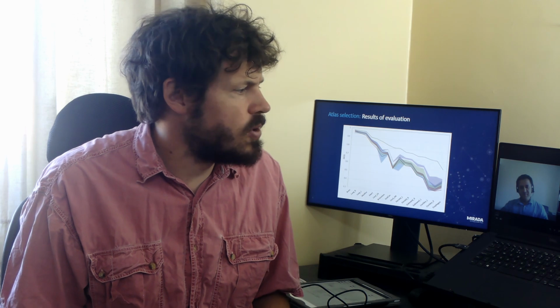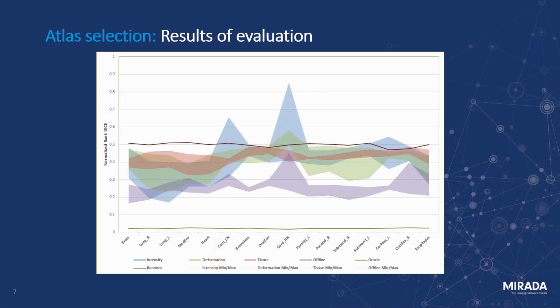So to overcome this, the authors have also plotted a graph in terms of rank. In fact, it's a normalized rank. To get a normalized rank, the authors have looked at the rank of the atlas selected as opposed to its performance. The different organs had different amounts of representation within their database, so they normalized that rank on a range of 0 through to 1. So 0 is the best atlas, and 1 is the very worst atlas for that particular organ.